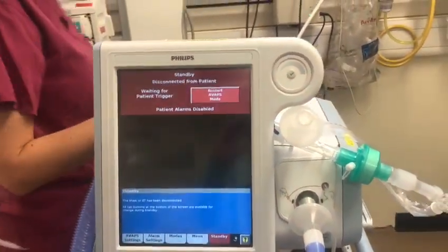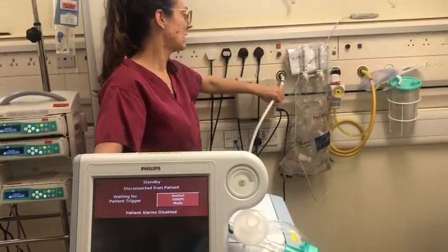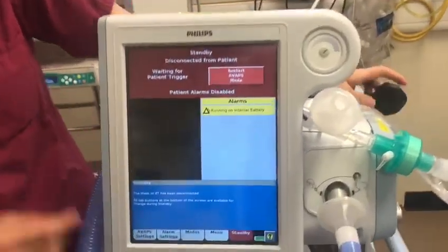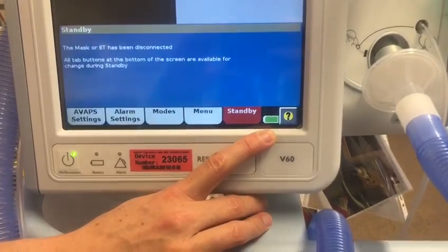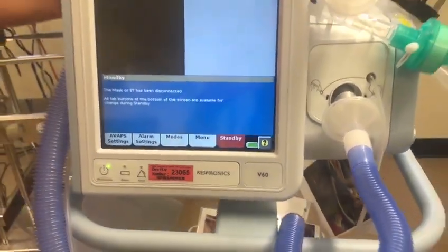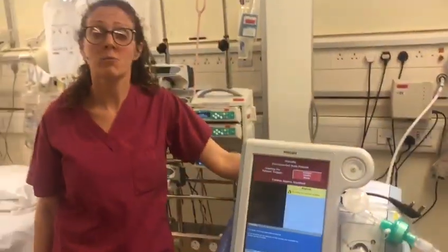You need to make sure that your V60 is plugged in and the oxygen is plugged in. We have a battery. If we unplug it, the battery sign will come up here. You'll have about 6 hours depending on your ventilation settings. If you have any other questions, please contact a member of the senior staff.